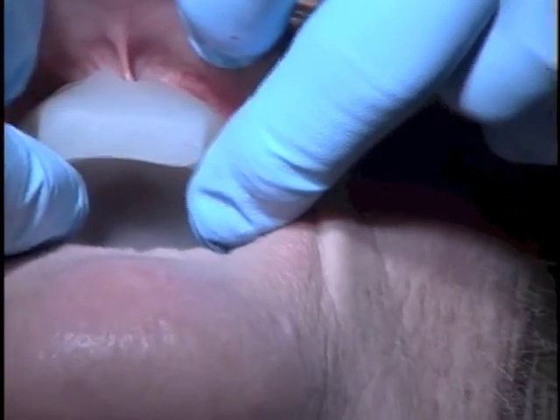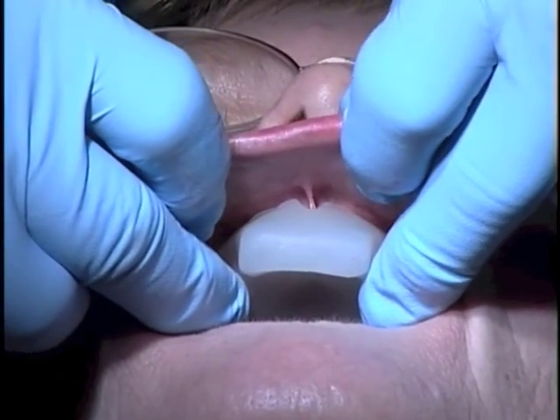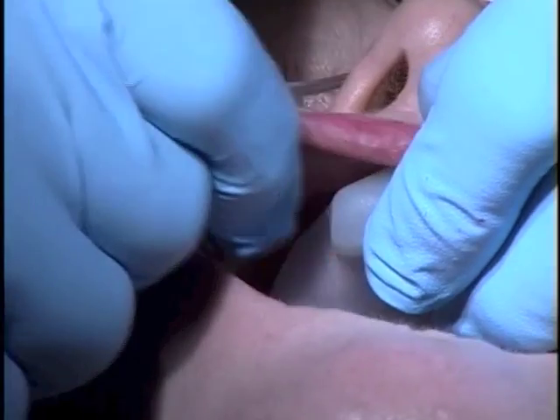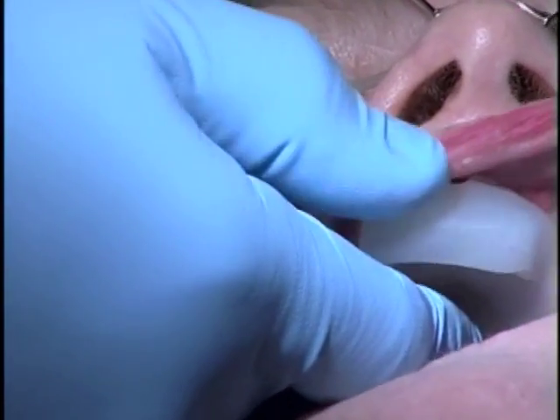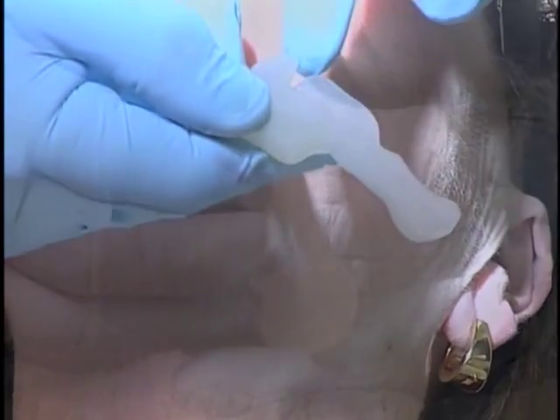Then we will want to judge the labial, and we see it's a little bit long just to the right of the labial frenum. So we'll reduce a bit there. We look at the other side, and that appears to be in good shape. So we need to reduce basically two areas, along here and along there.